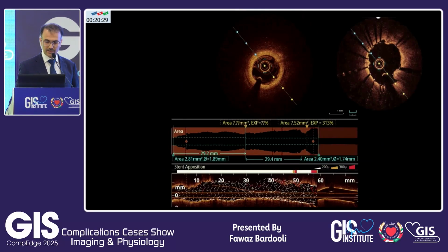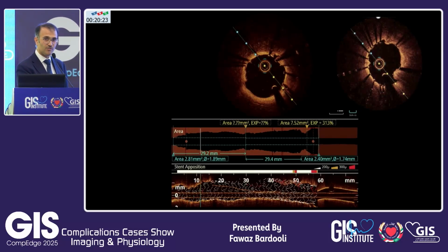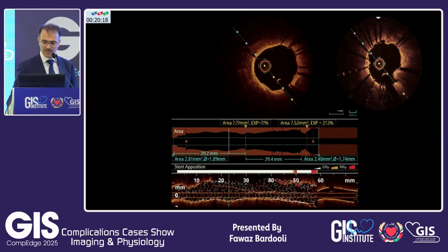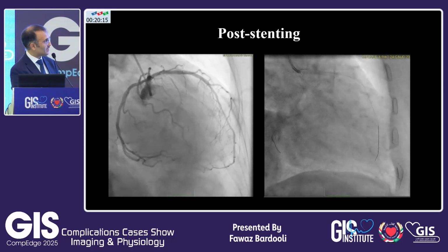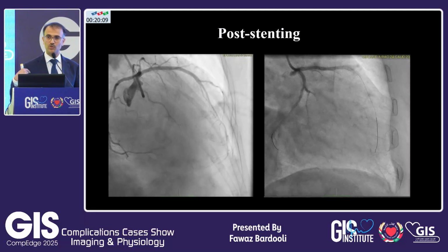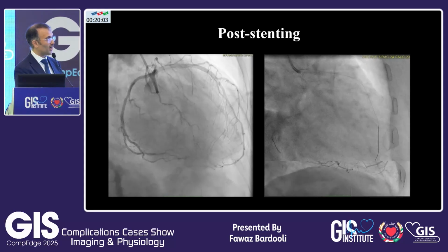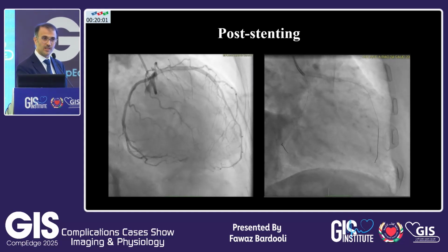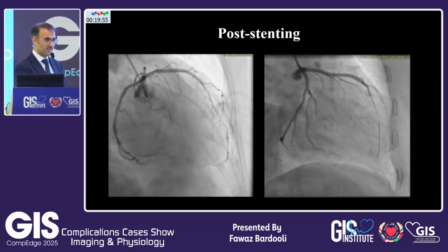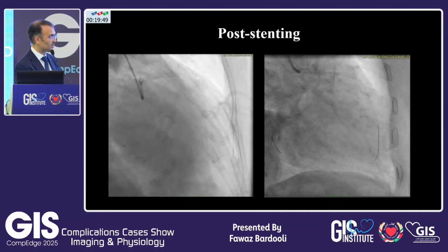Remember, this is after modifying this nodule with IVL, this is how we can get a good lumen gain and deploy the stent. The result angiographically looks good, yet there is still some haziness here. But because of my background of the OCT and the nodule, I stop myself and say, that is enough. Just imagine if I go with a high pressure 4.5 or 5 NC balloon here, and I perforate the artery, I'm going to be in trouble because any covered stent is going to jeopardize and cover my circumflex, which, as Dr. Wall said, is a very dominant left circumflex.